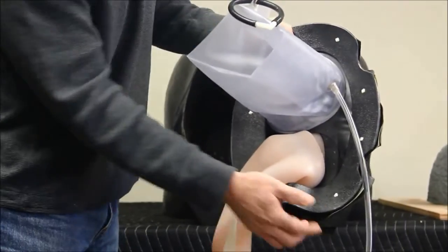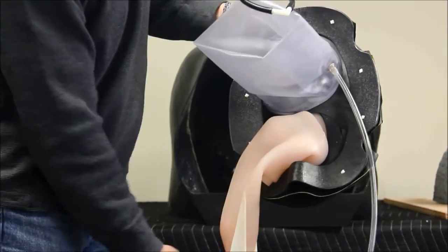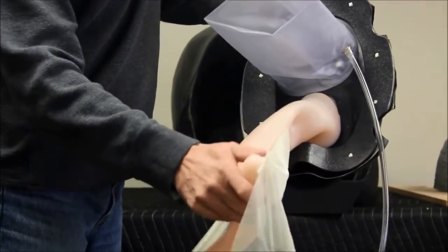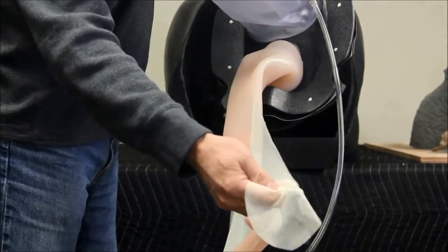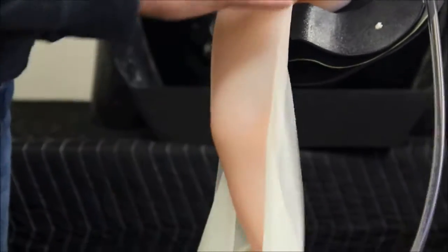This is the inflatable vinyl rectum, which is inflated through this tube with the provided pump. This is the Equine Uterus. The ovaries are attached using the small openings at the end of the uterine horns. The broad ligament is represented by the fabric and mounts to the body wall with the attached magnets.